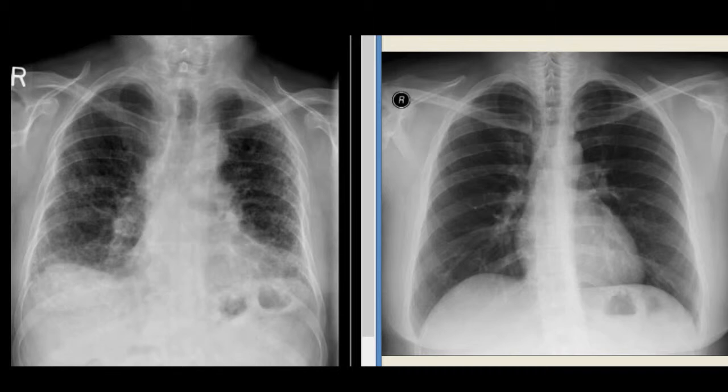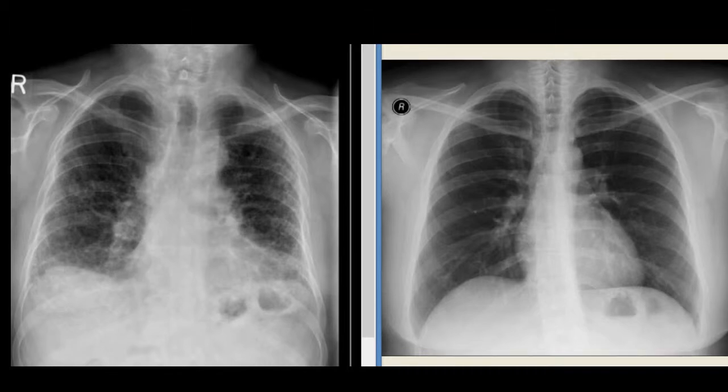There is no pleural thickening on the periphery. Right and left main bronchi seem to be tapering gradually as they enter into the lungs. There is no pleural effusion on either side, as the costophrenic angles are clearly visible.